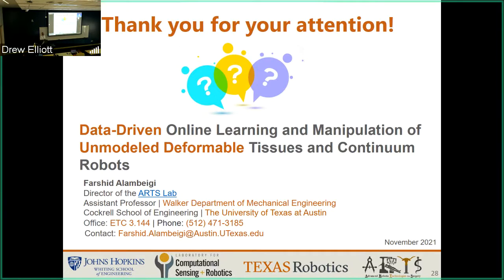Questions? Sure. Yes. I just have a question about when you learned the Jacobian for the deformable object. Was it an online learning process, or did you learn it offline and then adapt? The key point here was that we use iterative learning. We move or manipulate the tissue and we measure.